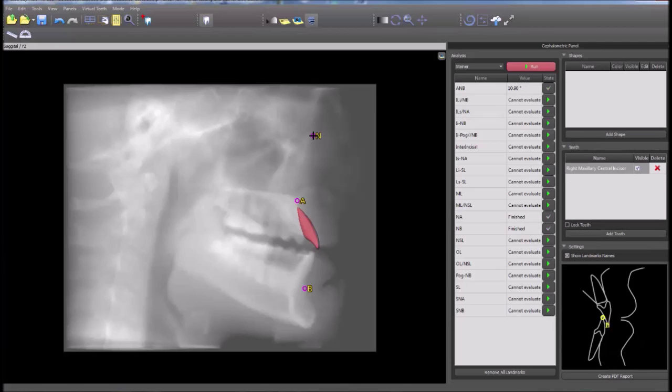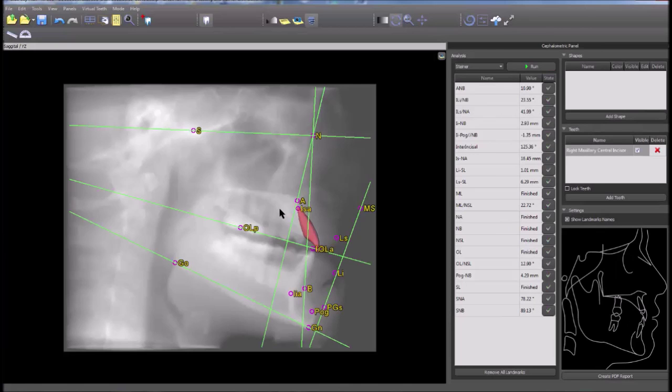Continue marking all points in the image until all relevant points have been identified and placed. Once all points have been marked, the calculations are completed and displayed on the image as well as in the analysis value column.